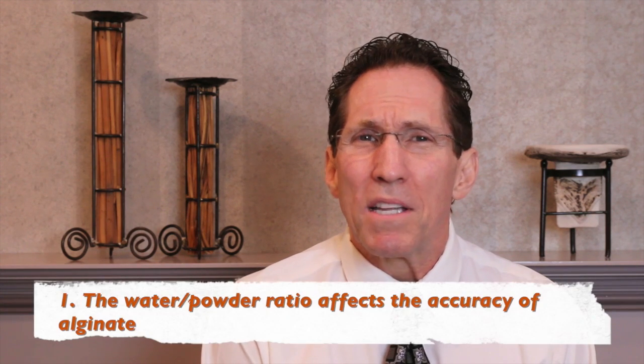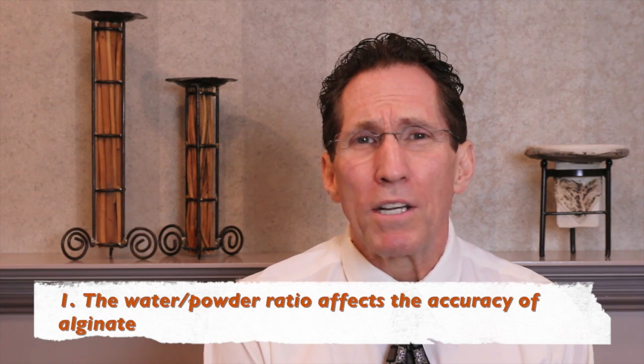First of all is the idea that the water-powder ratio somehow affects the accuracy of the impression. That's absolutely false. And that's fundamentally important because the water-powder ratio only affects the viscosity of the alginate mix and also the setting time. We're going to use that to our advantage because we're going to control the viscosity of our alginate impressions to an optimum for tissue control, for tissue displacement, and very easily being able to capture the details of the occlusal surfaces of our teeth.